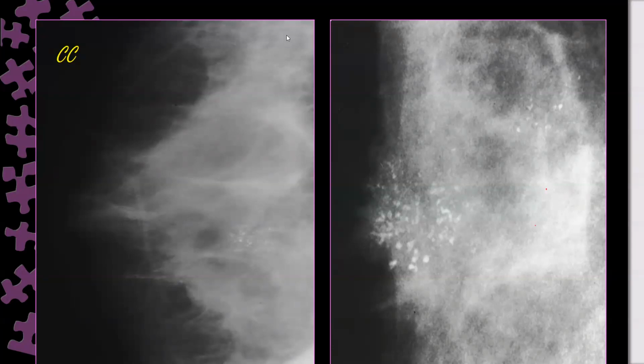Go ahead. Mediolateral oblique of the right breast showing. Where is the mediolateral oblique? On the left side. What is written here? It's written CC, but for me it is mediolateral oblique.